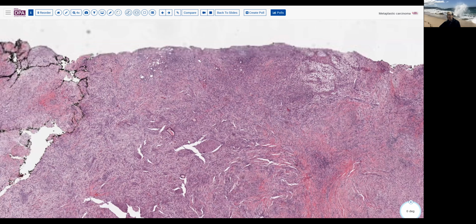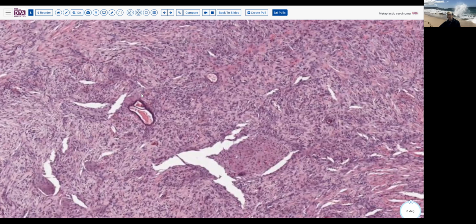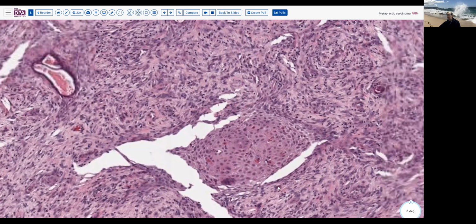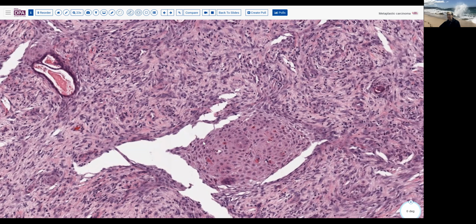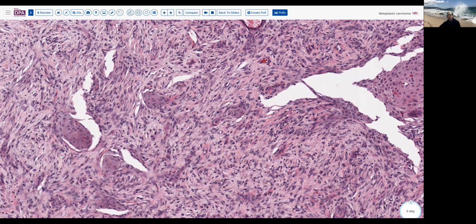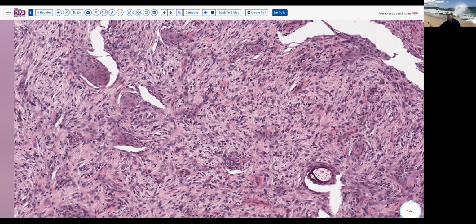The clue here being the identification of this very low-grade DCIS and occasional identification of, here you see features of metaplastic squamous epithelium sort of streaming off into that stroma. So I know that at first you didn't believe me that this was a carcinoma, but here you can see nice evidence of these little squamous pearls, or squamous morules, in this lesion, along with the focal areas of DCIS.